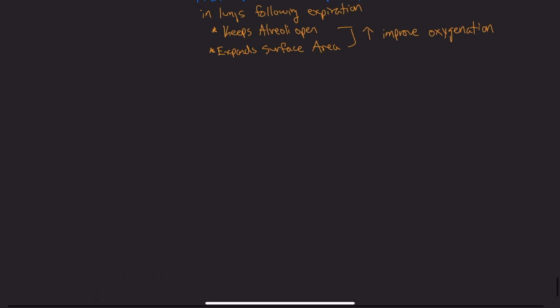So we're going to break this down into 3. When you're adjusting the settings on the vent, you're going to be trying to correct most likely 3 major issues. So we'll start here. The first one is going to be your patient is not breathing enough.